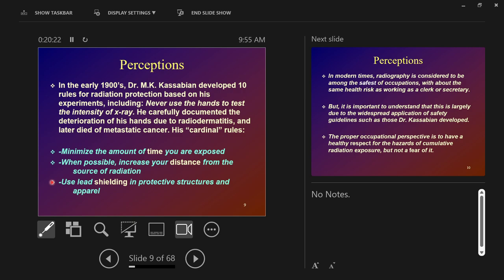So when you go into our X-ray room, if you look at the edge of the wall, not the face of the wall, you'll notice you can see the wood paneling, then a dark layer, and then some more wood behind it. That dark layer is the lead paneling. It's about 1/16 of an inch thick, and it comes in big sheets, like 4 feet wide, so they're really, really heavy.